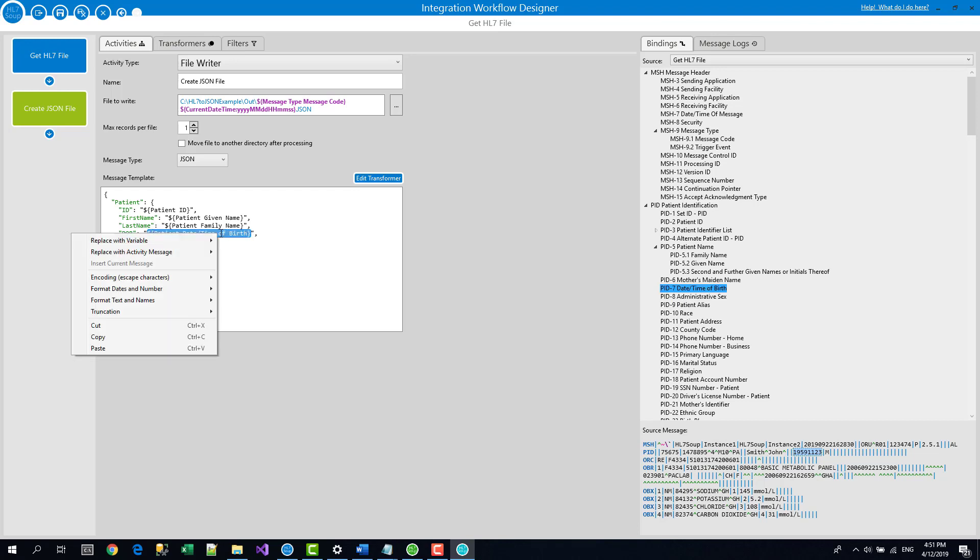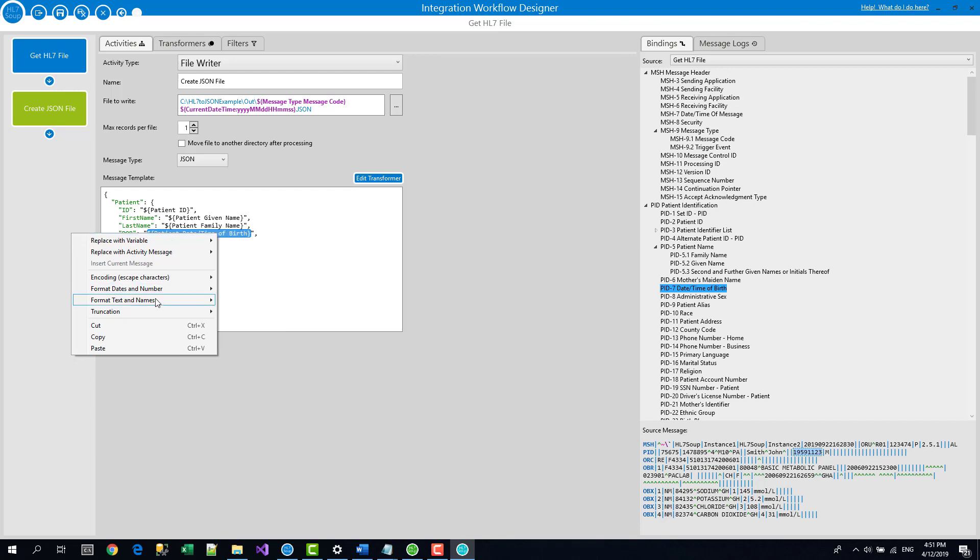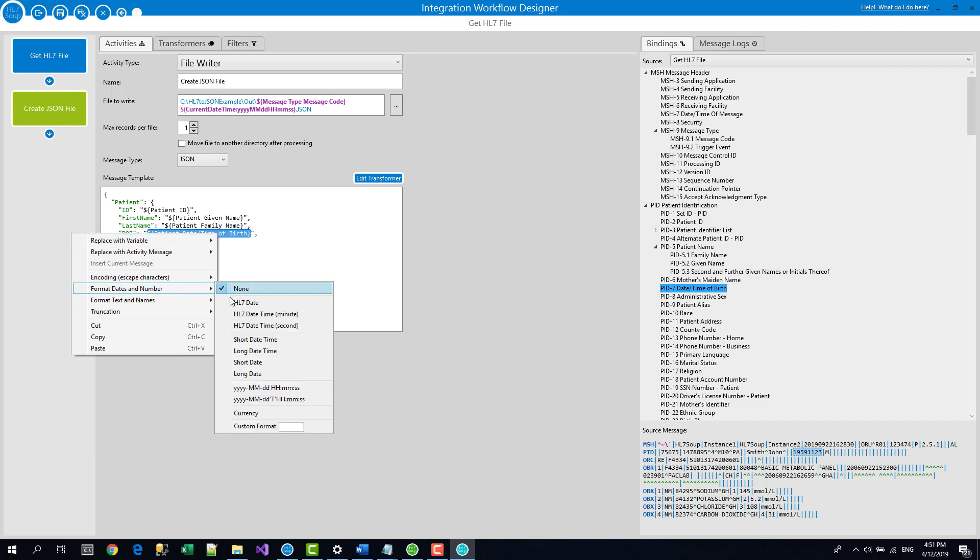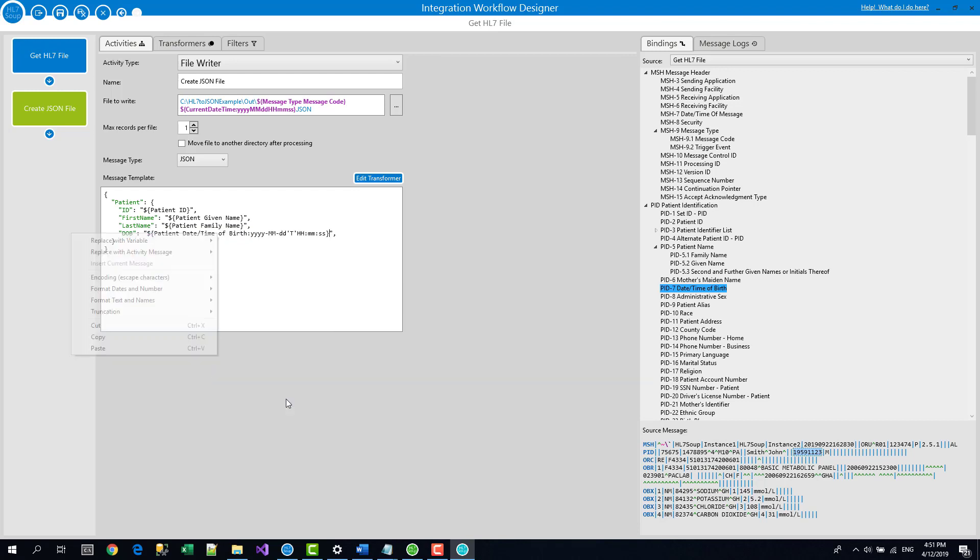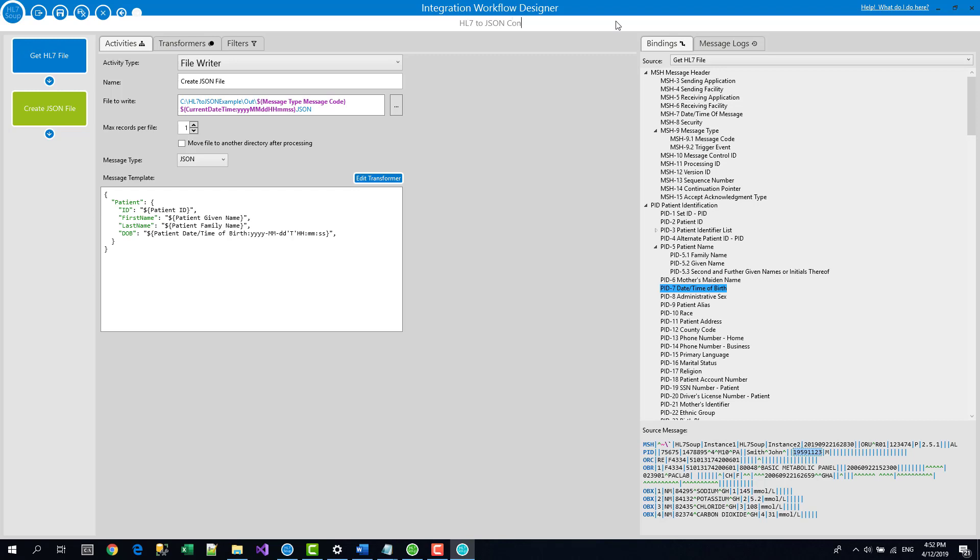With the date of birth, we are going to want to format that again. Didn't mean to replace it. We want to format it and I don't want it as an HL7 date. I kind of want this. This is going to go to .NET so I have that .NET date format for me. Okay, simple. So that's mapped those two together.